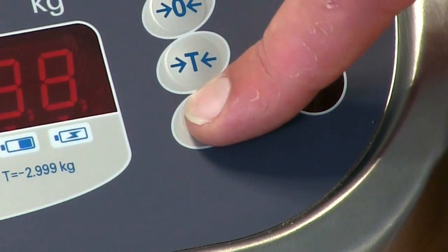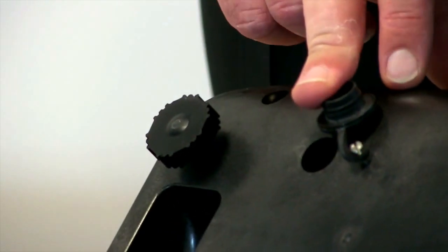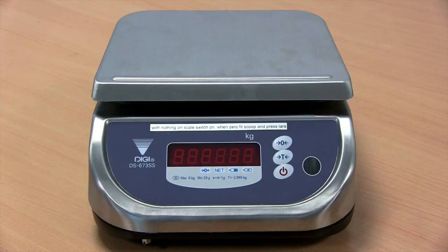The DS673SS can be run either from the internal rechargeable battery, which makes it a completely portable scale, or from the AC adapter which is included. The rechargeable battery will give you at least 40 hours of continuous operation between charges.